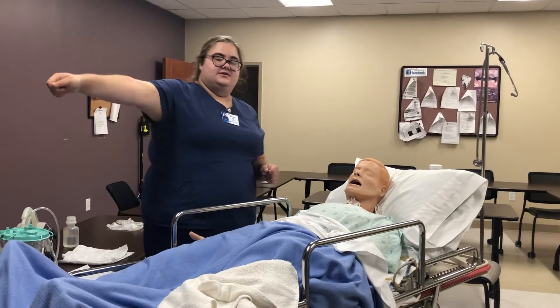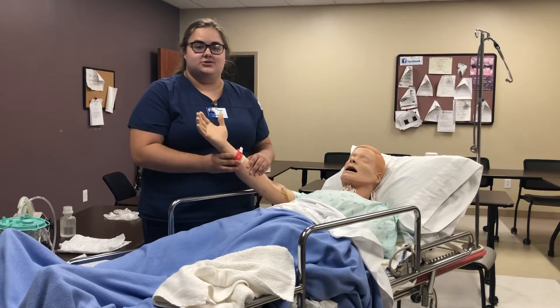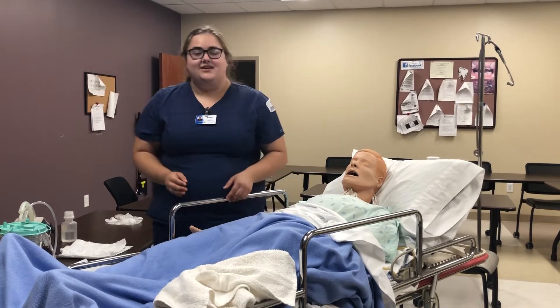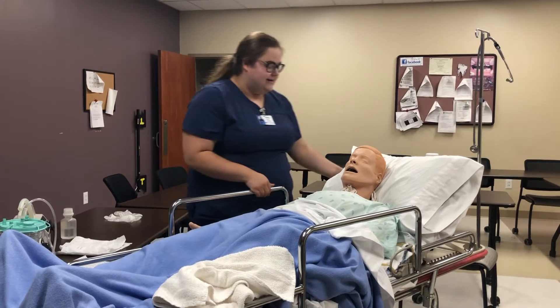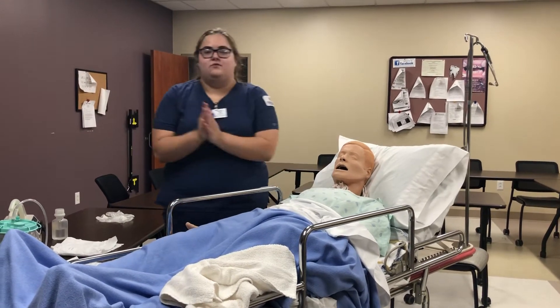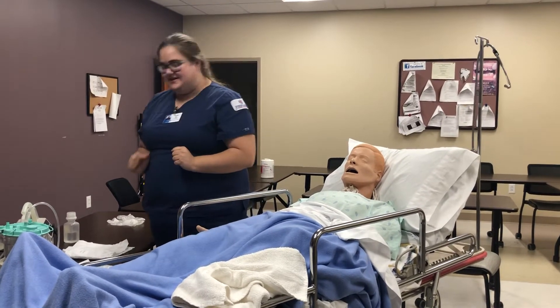First you pull the curtain for privacy. Then you check the patient's ID to make sure you are doing it to the correct patient. Then you want to elevate the head of the bed and perform proper hand hygiene. Now we are ready to start our task.